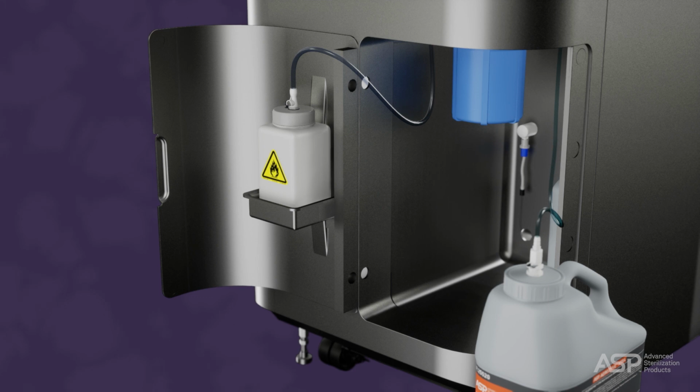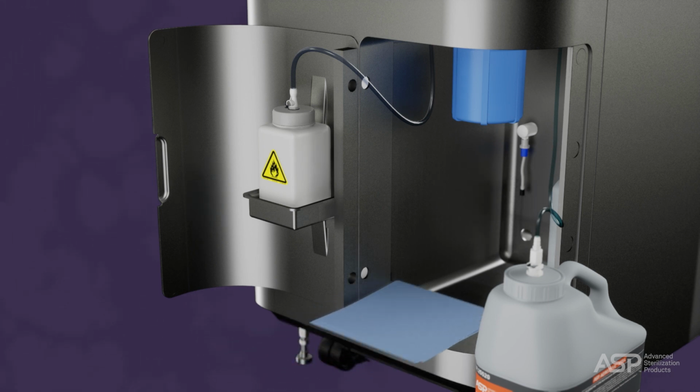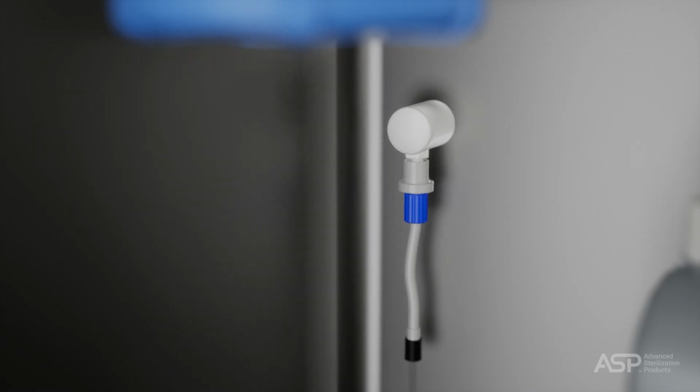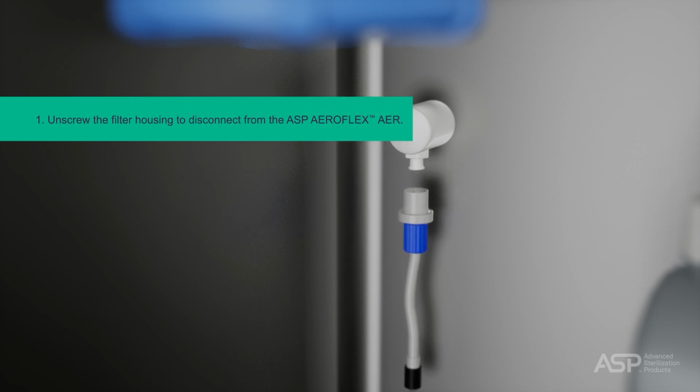Do not disconnect any tubing. With the MRC filter exposed, place clean towels underneath the MRC filter to contain any drips. Unscrew the filter housing to disconnect from the ASP AEROFLEX AER.